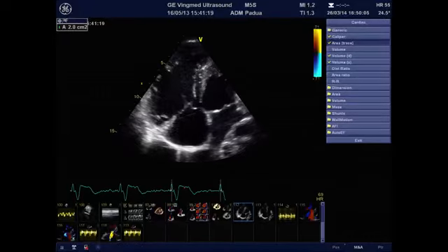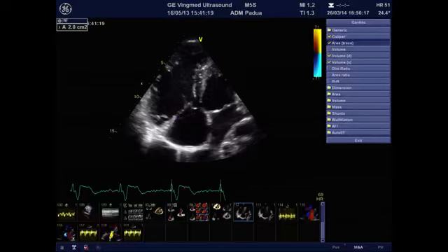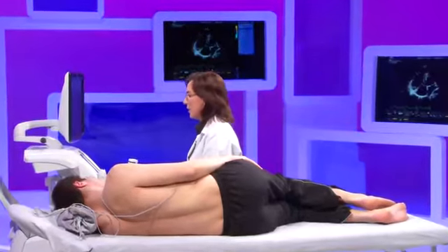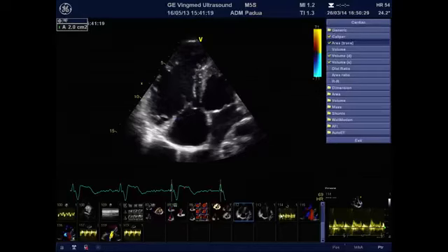When this area is larger than 1.7, it is a very good predictor of recurrent tricuspid regurgitation if the patient would go to surgery. So this is also a prognostic marker in terms of postoperative outcome, and should be done in every patient that will be subjected to cardiac surgery.